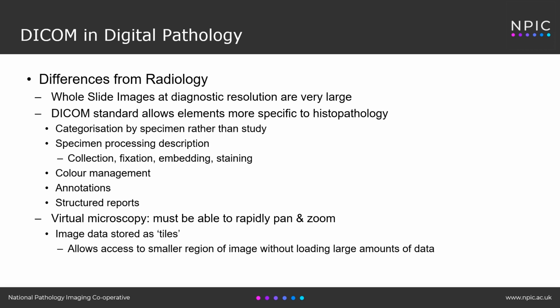It allows the storage of annotations, and by this we're not just talking about the standard annotations that a radiologist or a pathologist might make whilst looking at a digital image to mark an area or do a measurement on the image itself, but more complex annotations such as might be used in AI applications. For example, if an AI application is highlighting all of the nuclei in a particular area or a particular field of vision, it allows the precise recording of the outline of each of these nuclei as an annotation, and also allows structured reports.